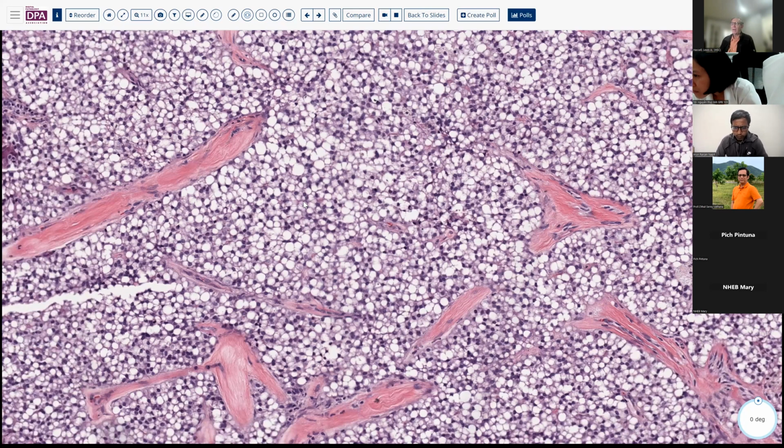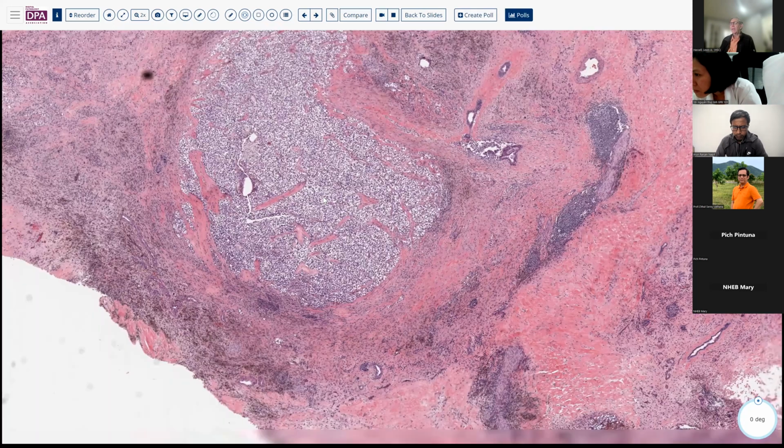So this is an area where I would be interested to know what our immunophenotype would show us and if that would give us the clue to a viable area of residual solid pseudopapillary tumor. Here's our remaining pancreas over here.